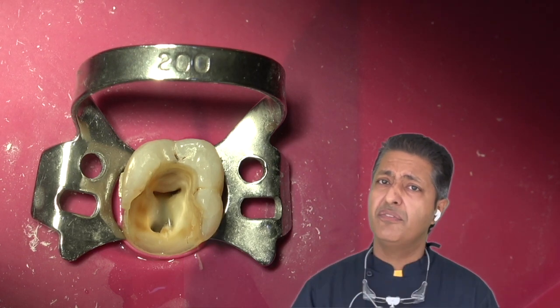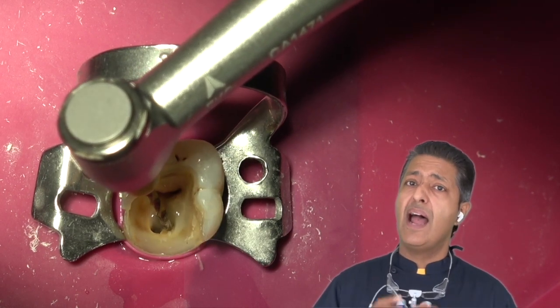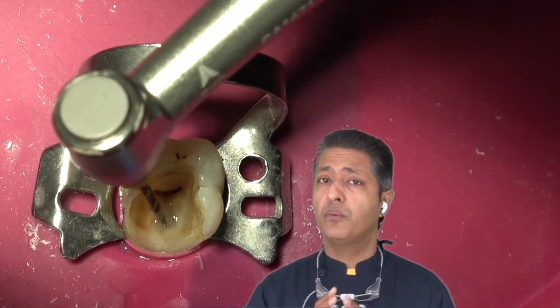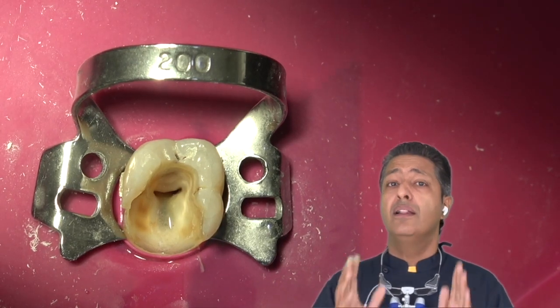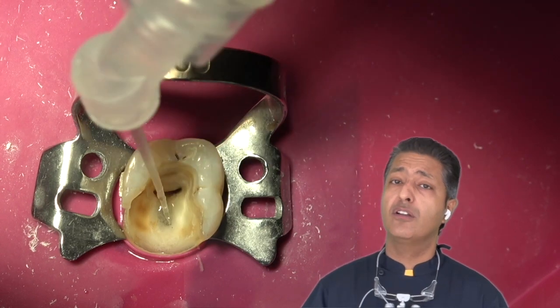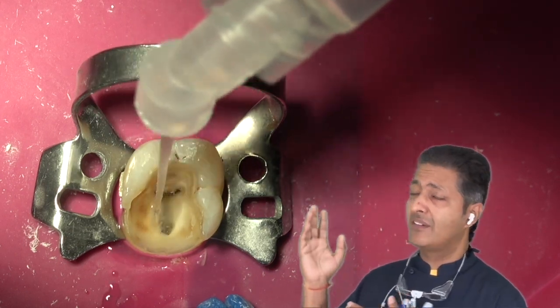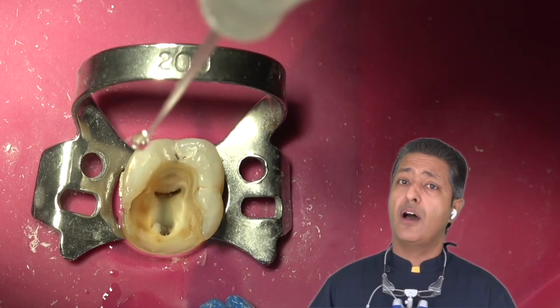Just insert the file in the root canal till the point of resistance and start using it. The intention or the purpose of this file is to just widen the orifice. It is not shaping the whole canal, but just widening the orifice, because once you irrigate the widened orifice, a lot of bulk of debris comes out, as you can see on the screen, and also the irrigant comes out in bulk.